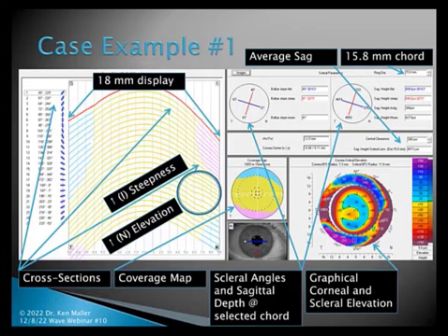So that would give you an idea, at a diameter of 15.8, what sagittal height you're probably going to need as an average around this eye, so that you will be able to create that central clearance of 300 microns. You can, of course, change that value.